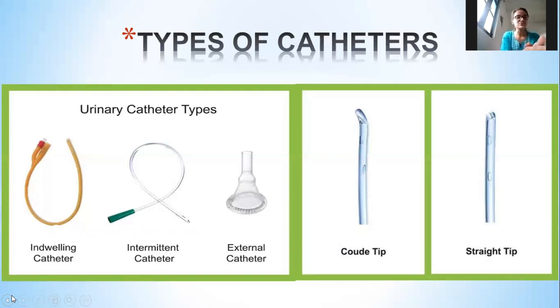And the first one, the indwelling catheter, which is the double lumen catheter I told you about. This is the most common one, which is used in clinical practice.